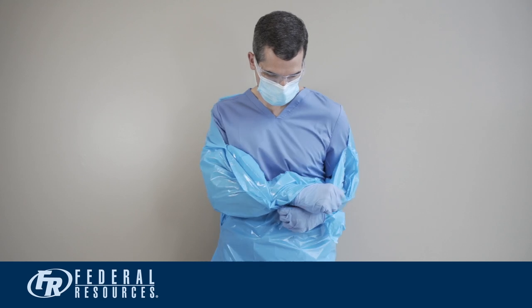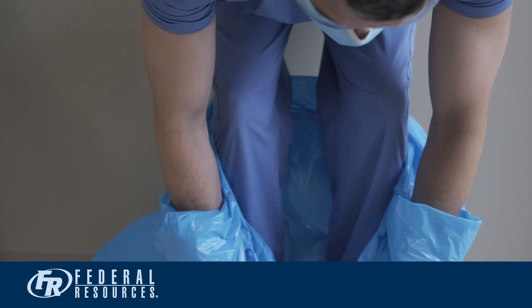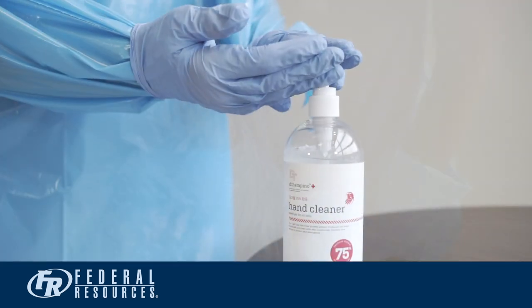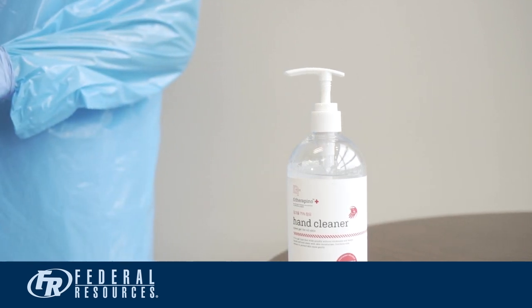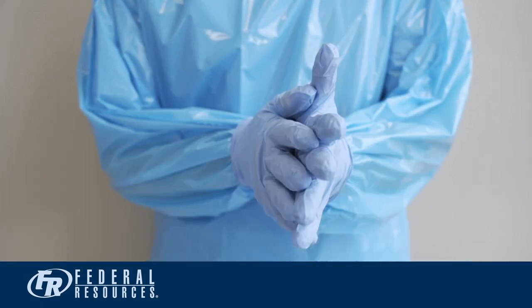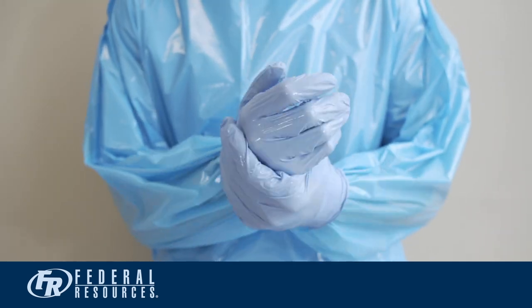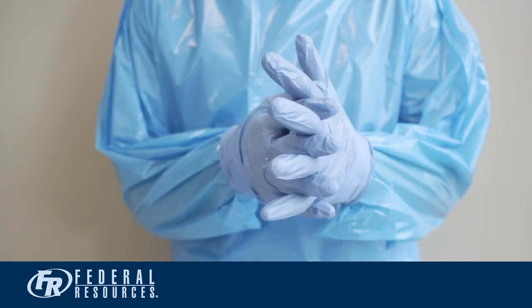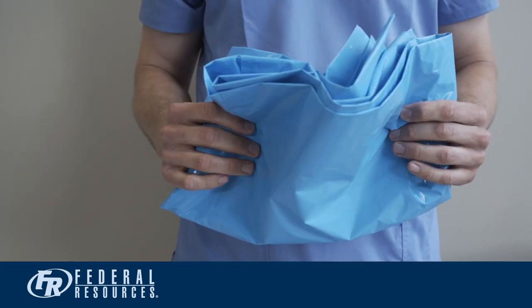You are now ready to safely perform patient care. Now, let's go over the safe removal or doffing of your PPE. The first step to safe doffing is to perform proper hand hygiene. Apply alcohol sanitizer to your gloves. Rub your hands together vigorously for 20 seconds, making sure to cover both hands and all the fingers, front and back, as previously covered. The first piece of PPE to remove is your disposable gown.